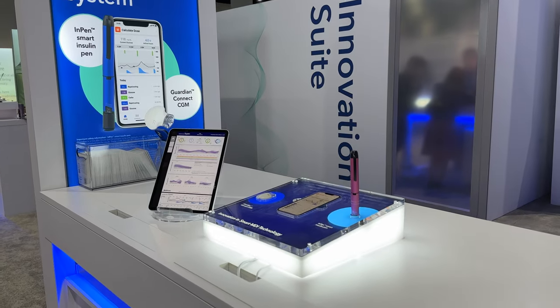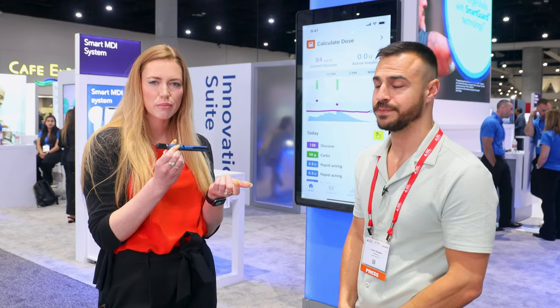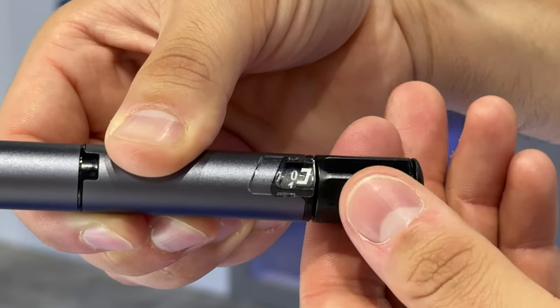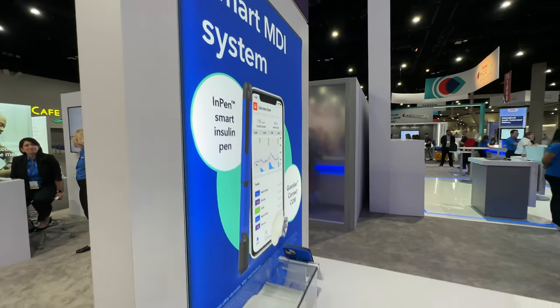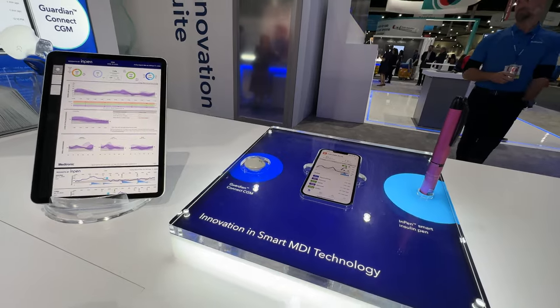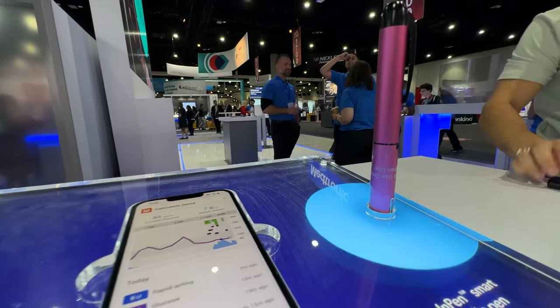What is InPen? Think of InPen in two pieces. One is the hardware - that's the actual physical pen. I have one in my pocket. This is the actual pen you're using, very similar to a disposable insulin pen where you're dialing the amount of units you want. We dose in half-unit increments up to 30 units in one single injection, and the pen is where the smarts live. It tracks all doses being taken and syncs with the app, where you engage with different features and see all doses being logged.